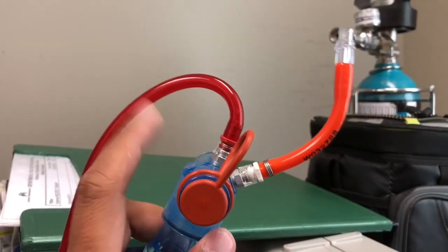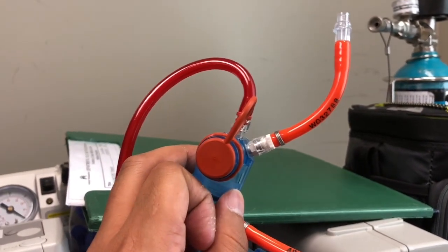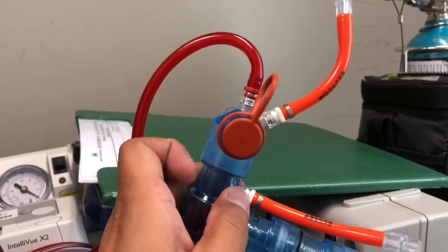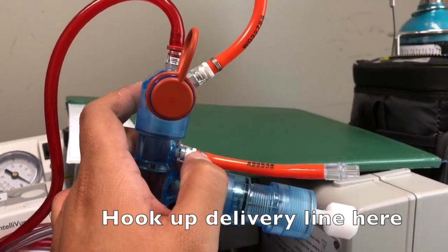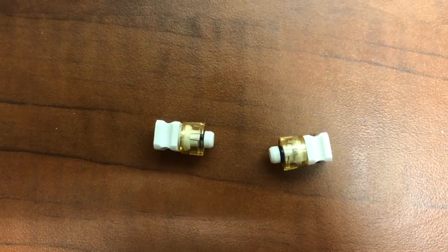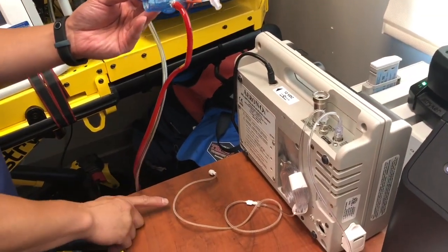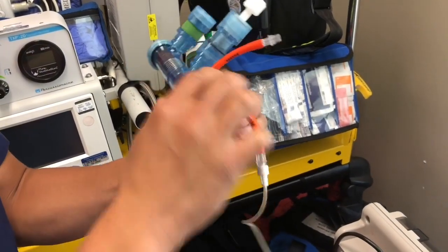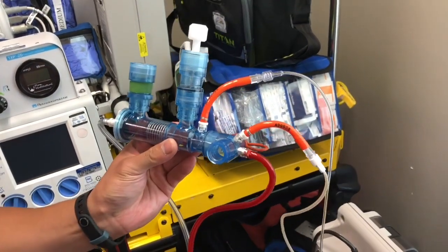After you put the dual head on, this is the pressure manometer, which you normally have on the Broncotron circuit. But now you're going to be able to sample nitric on this line. Take the cap off and hook up your second red line — this is actually where you're going to be delivering nitric. After taking those caps off, make sure to save them. Next, connect the sample line to the top part, then take your delivery line and connect it. Now you're set up.